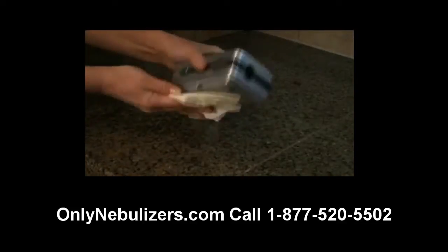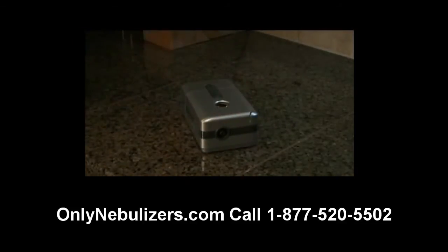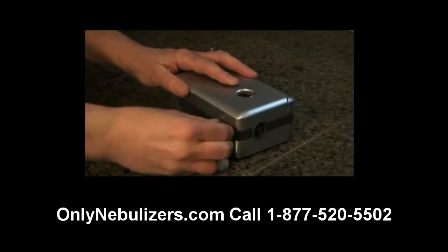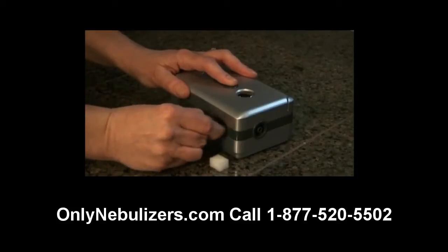Remember to clean your compressor every few days with a damp cloth to keep it dust free. The Traveler compressor filter should be changed at least every six months, sooner if the filter is discolored. To replace the filter, simply pull back the rubber cover tab on the side of the Traveler.